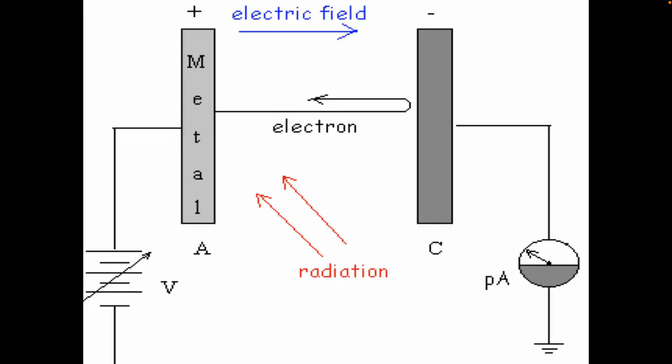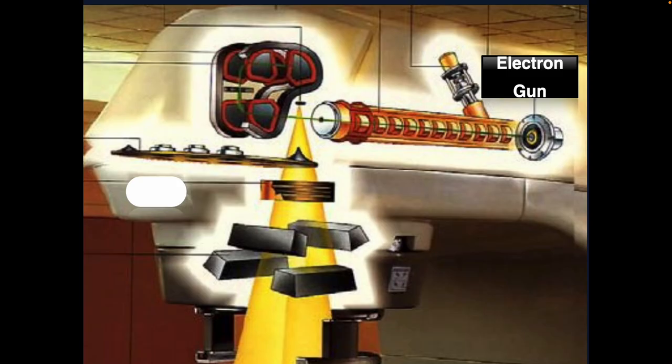If you remember, during secondary school we had this very small experiment with a cathode, anode and a battery through which we can generate a very low electron current. The same happens in the linear accelerator head, where the electron gun generates a very weak electron beam. But this electron beam at a range of kVs cannot be used for daily treatment. So we need to take these electrons and accelerate them in the most important part of your linear accelerator, hence the name linear accelerator, to accelerate the electron inside the accelerator tube.